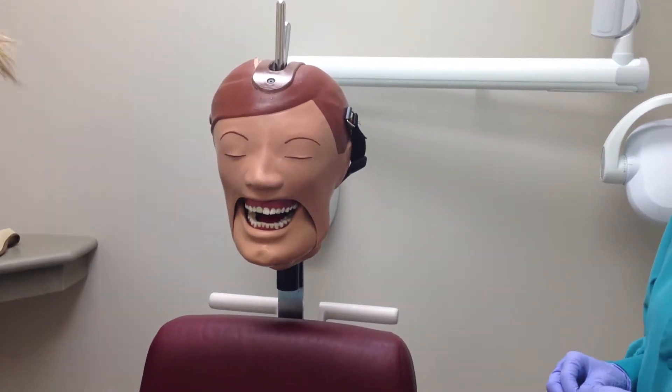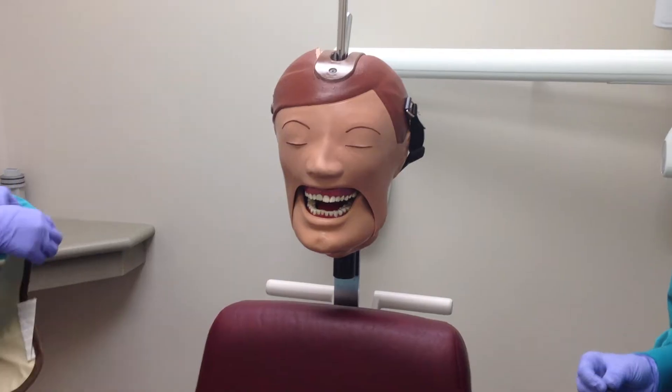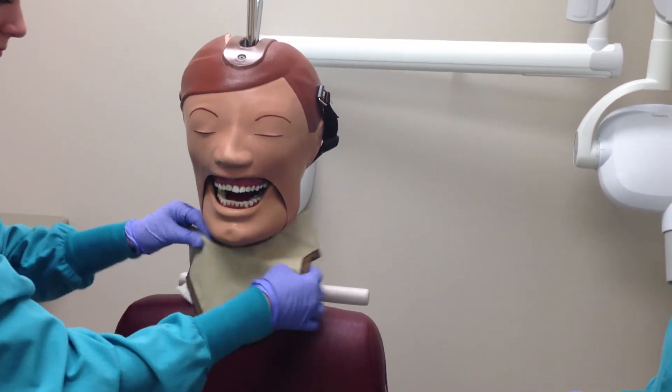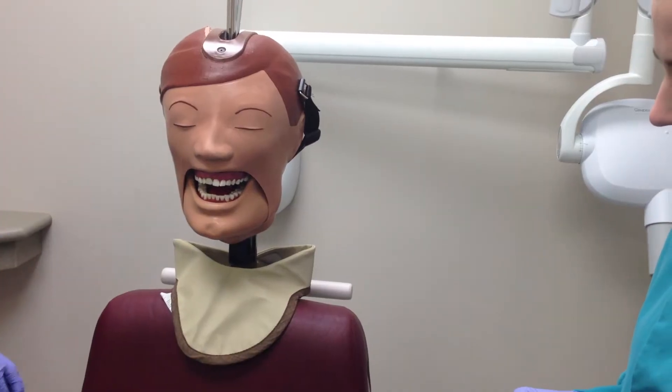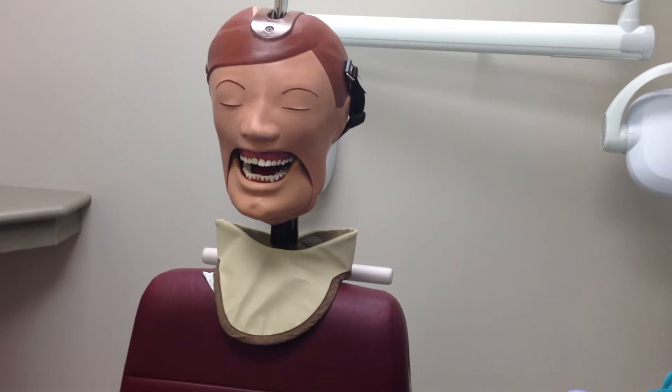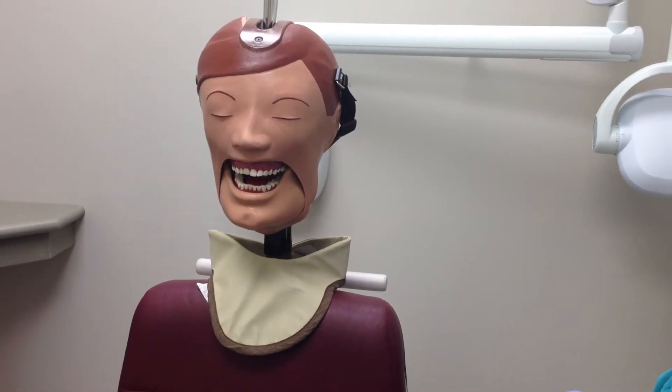Now place the thyroid collar around the patient's neck for protection. Have the patient remove any objects from the mouth such as dentures or retainers that may interfere with the procedure. Also, eyeglasses must be removed now.